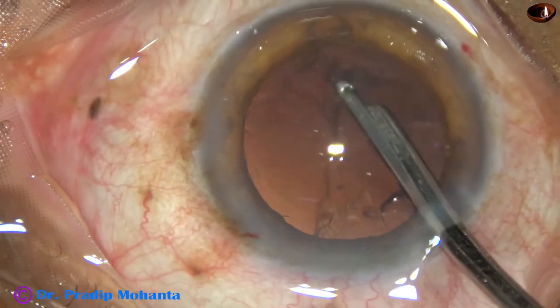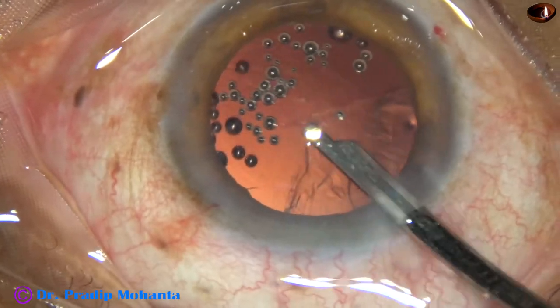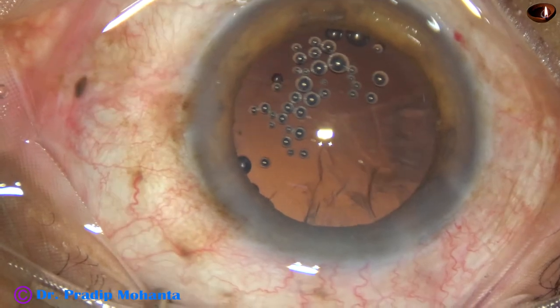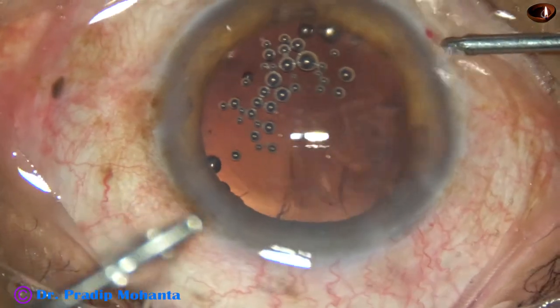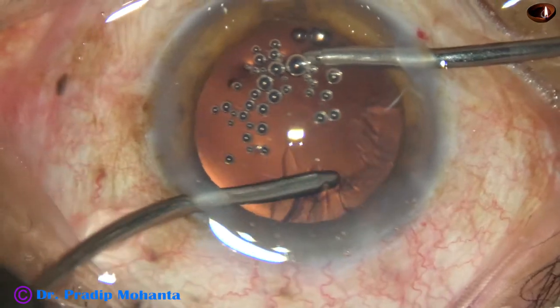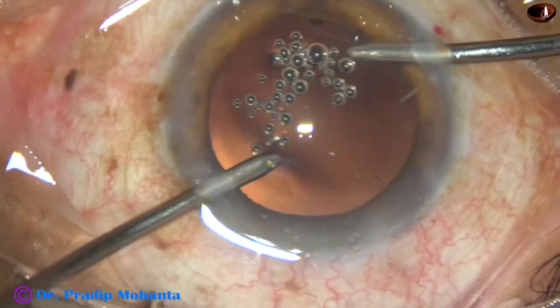Now the cortical cleanup is being done with the help of a Simcoe. By the time my assistant is ready with the bi-manual irrigation-aspiration, I take the bi-manual irrigation-aspiration and irrigate from the right side to remove the sub-incisional cortex and the cortex around the main incision.